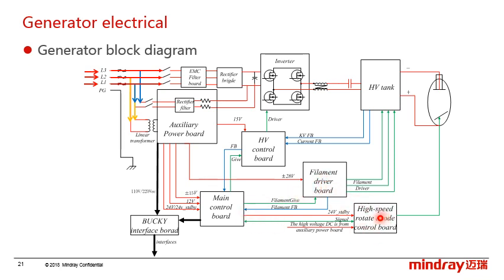And the control board is powered by the master control board, and it also has a high voltage from the auxiliary power board.